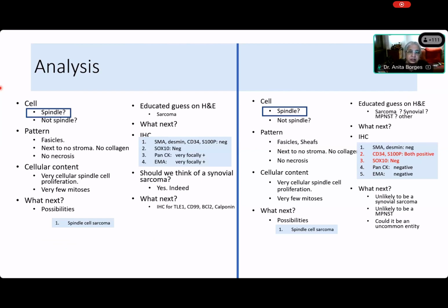But nowadays we have a little bit more specific immunohistochemistry. We do INI1, which is SMARCB1. That is what we do on INI1 because in synovial sarcoma you get patchy loss of INI1. We've noticed it now many times in these tumors, and of course you can get the SS18 protein because you get a translocation, right? SS18, SSX, and now we have an antibody to the SS18 protein. On this side, we'll have to check and see which uncommon entity we are going to find.